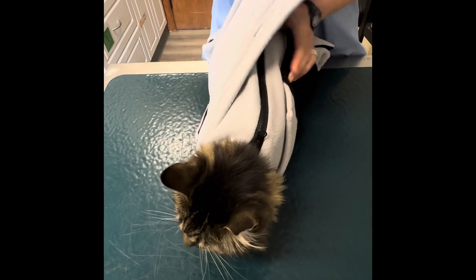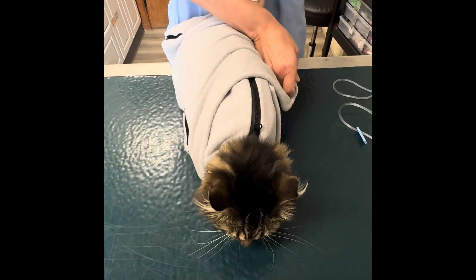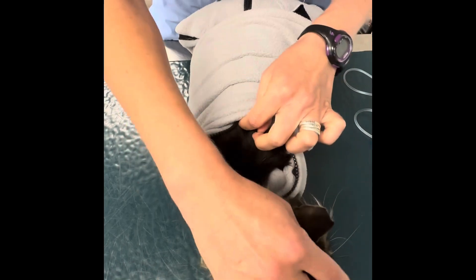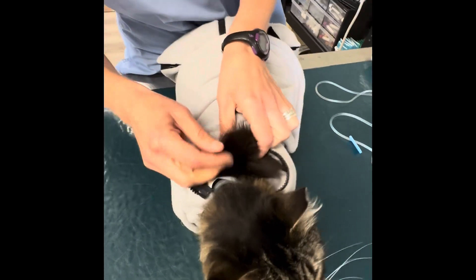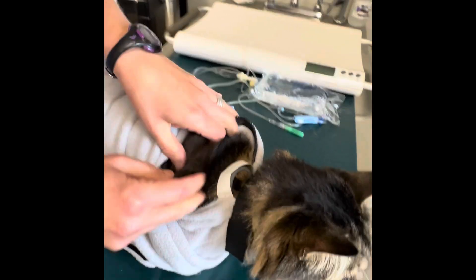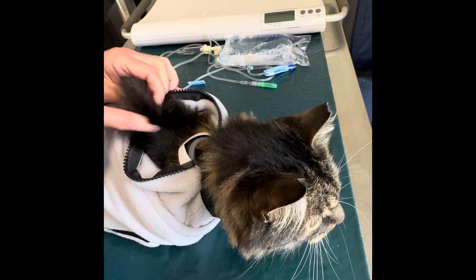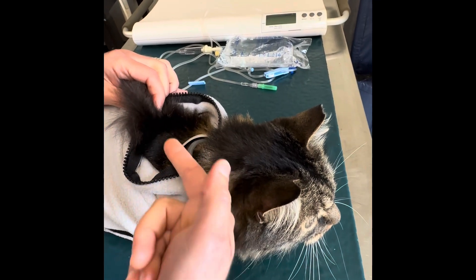Now normally I do it up here, but because I'm going to do fluids, I'm going to pull this back a little bit because I want access to this space. And so I'm going to pick up some fur. He's a long-haired cat, so this is going to be tricky to see, but really I'm picking up a bunch of skin between my thumb and my forefinger and I'm looking for this sort of divot that I can get my finger in.